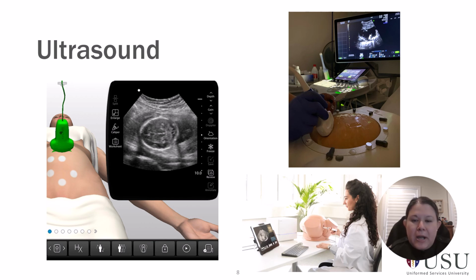And then down here on the bottom is another virtual simulator application with a transvaginal probe, which again has some different hand motions. That's also available in the SonoSim module as well.